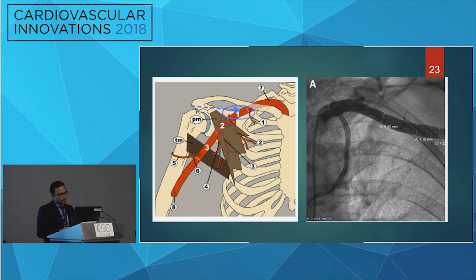So we're just doing a percutaneous approach. This is more favorable from what I was reading. For a percutaneous approach, that's more favorable than going just down from axillary, I thought. From your pictures, you were a little more distal in the subclavian area, and you call it an axillary access. So I was just wondering, were there no options closer, or am I just wrong? It just looked a little more distal in the artery, proximal, I guess proximal would be the better word.